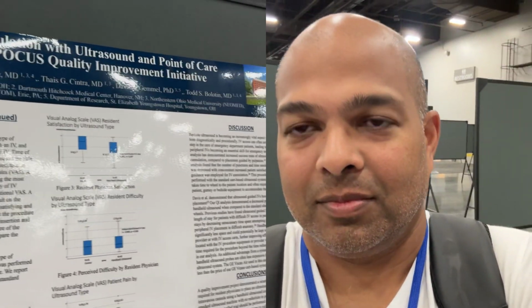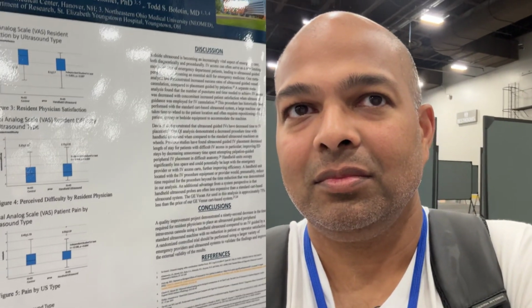So that was a very exciting finding for us, especially known that IV access can sometimes be the rate-limiting step in emergency department visits. Some limitations to our study included that this was a non-randomized quality improvement rather than a clinical study. There's also a lack of generalizability, as we were all residents trained in ultrasound performing this, which may not be the case all over the country. And there could be a reporting bias, as the handheld ultrasound was a novel device to some of the residents performing this. But we look forward to doing more research with this, hopefully looking to compare infection rates for handheld versus standard cart-based ultrasound in the future.